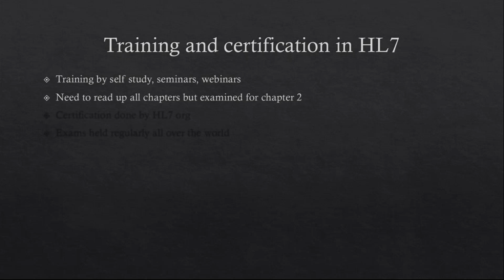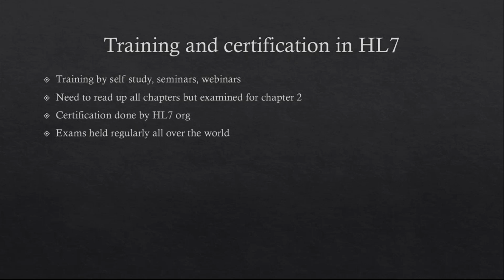As I've done it already, I have the material which we have to go through for HL7 messaging, HL7 certification for the 2.7 version, which is currently being organized by the HL7 organization. As I said, certification will be done by the HL7 org, and HL7 exams are regularly held all over the world. But you have to pay for the certification. Like, how much? Like $120 or some?